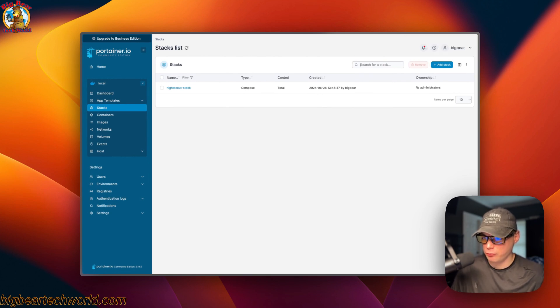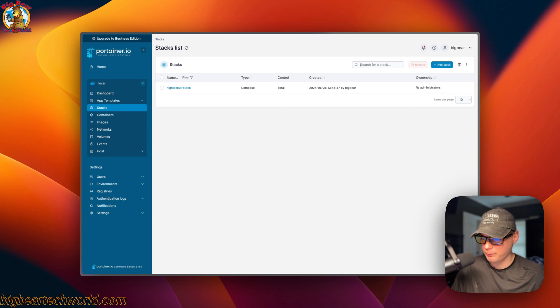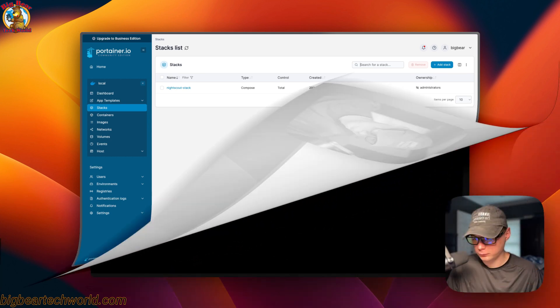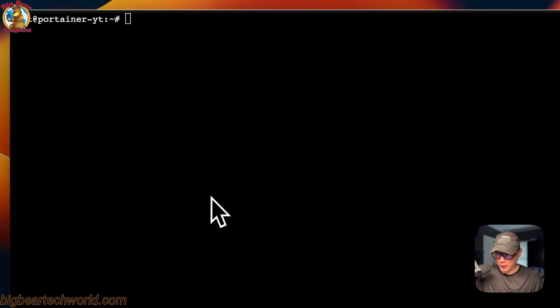I'll go ahead and deploy the stack. Now it's deployed and set up — what happened was it downloaded the Docker image from the registry, extracted it, and brought it up with Docker Compose using the Docker engine. It also set up the network and volumes.